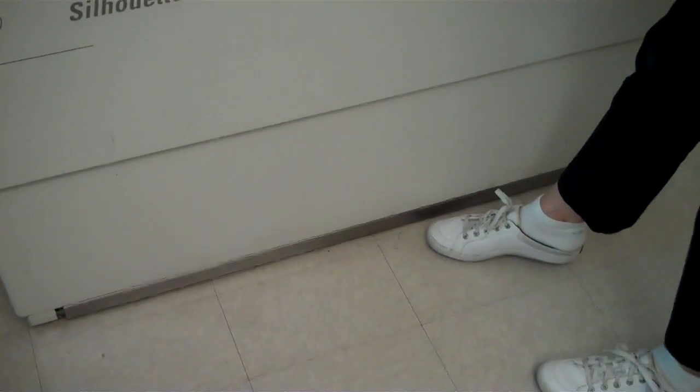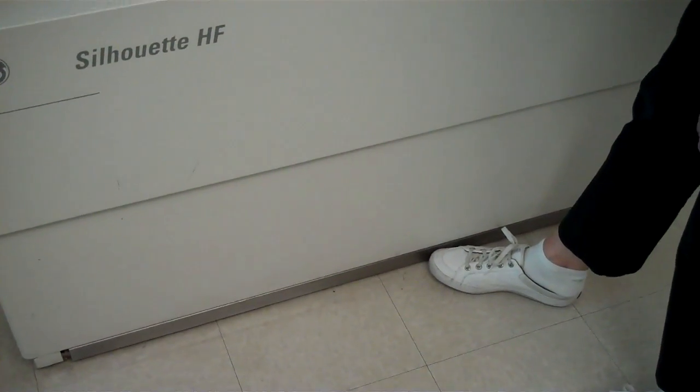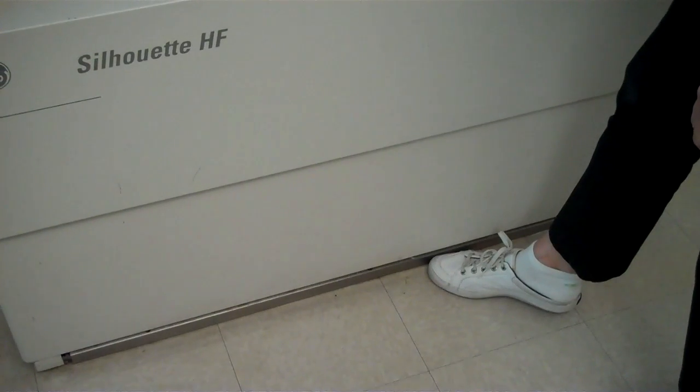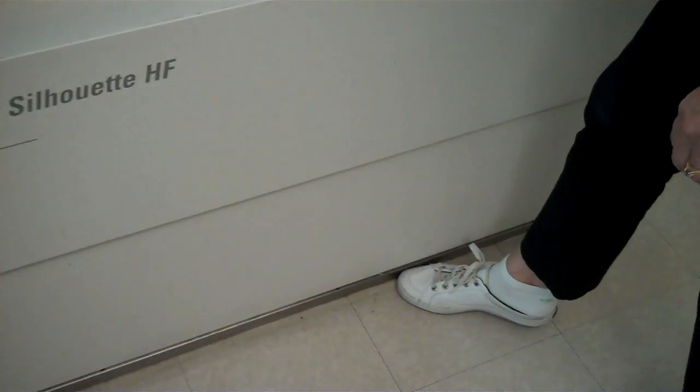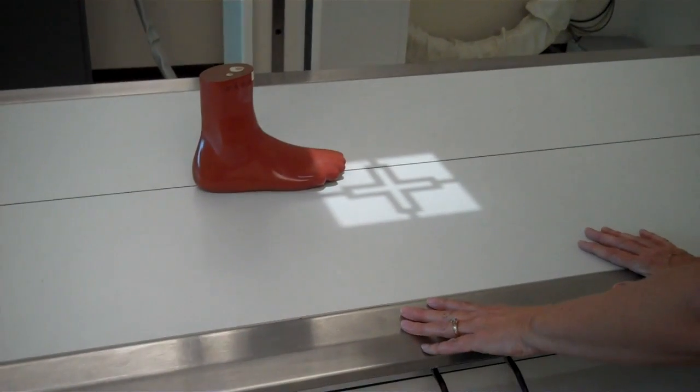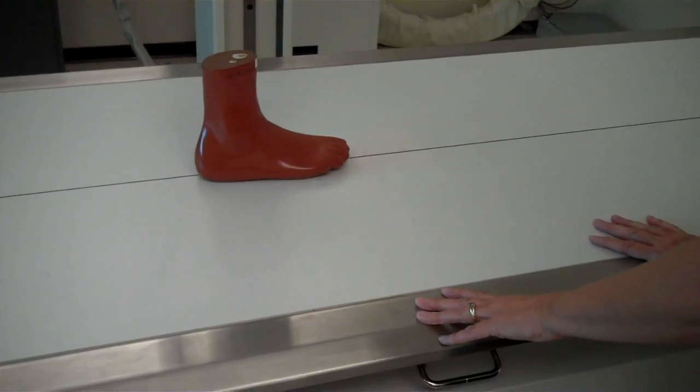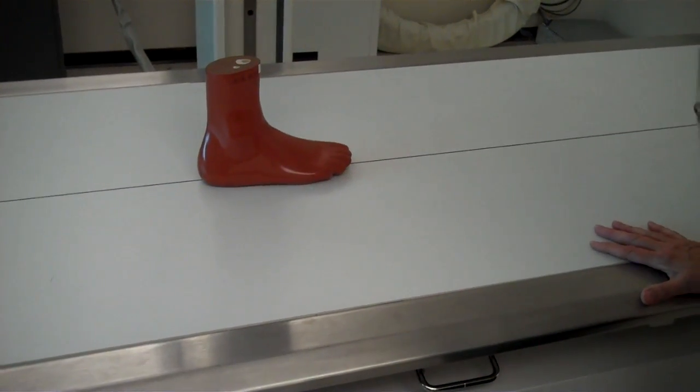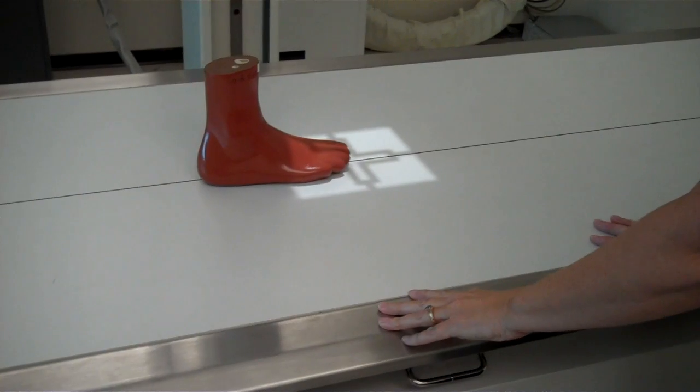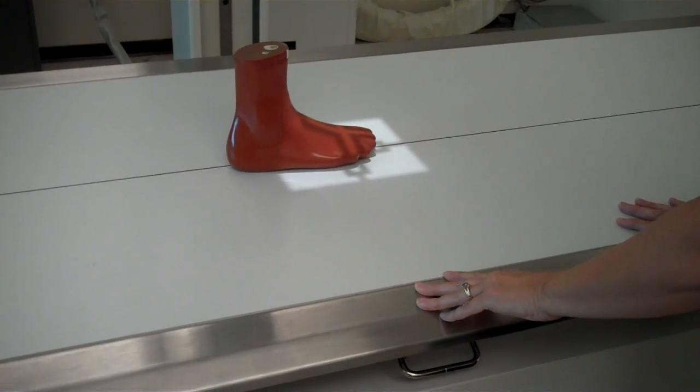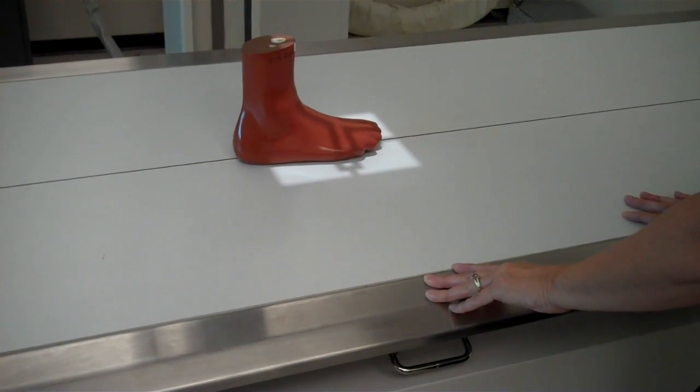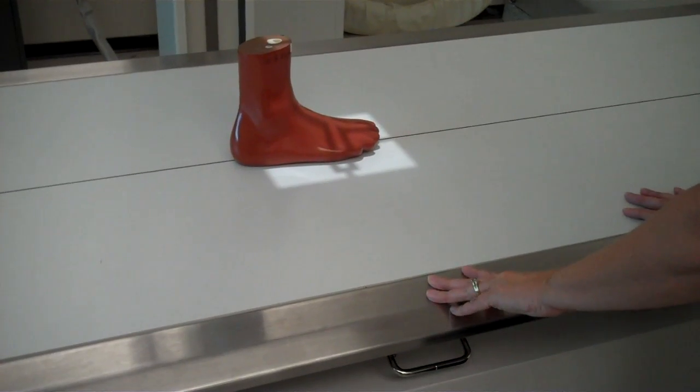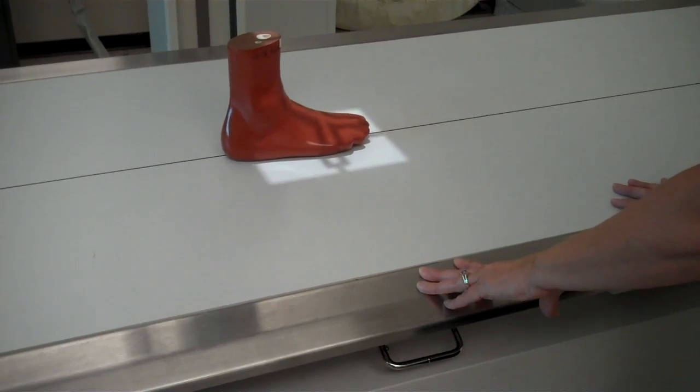At the bottom of the table, there's a silver bar. You want to press against it with the front of your foot. It will activate the table to be free floating and we'll be able to move in all four directions the part to the center of the image receptor.